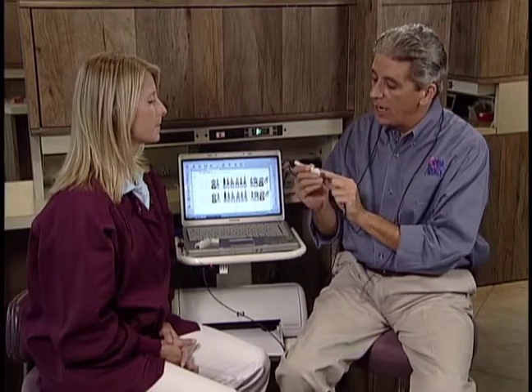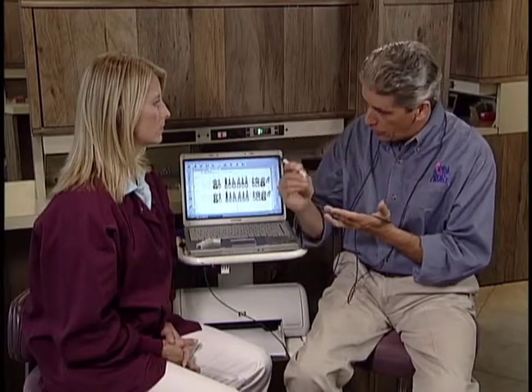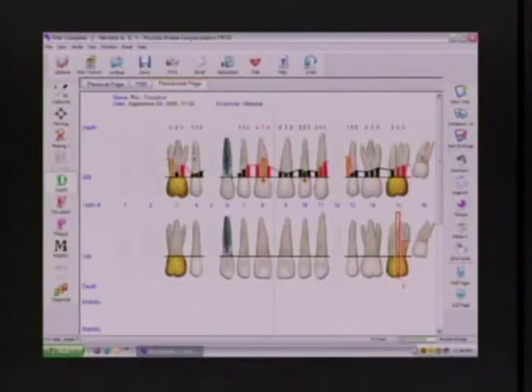So this little blue button on the top of the handpiece is a frictional override of the constant force pressure. It turns it into a traditional probe. So now I can use that blue button, go through or by that calculus ledge, by that crown margin, find the true bottom of the defect, then let go, contact the margin, and take my measurement. Danger, 8.